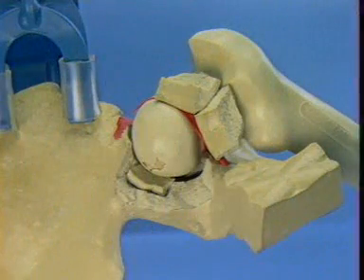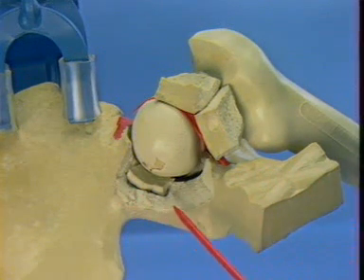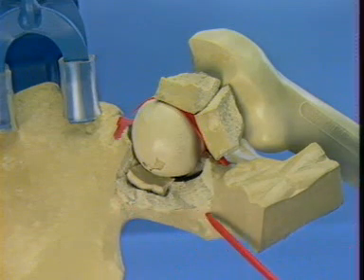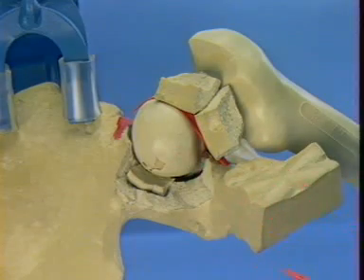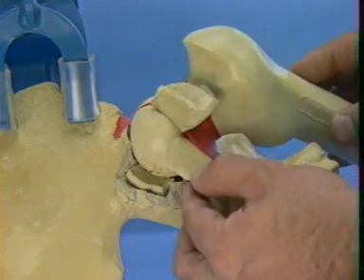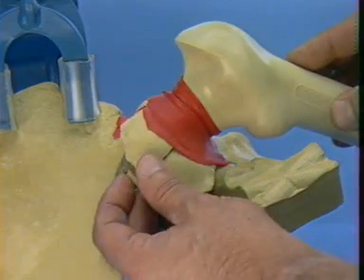The bone is placed in a vise as if the patient were in the lateral position and the surgeon standing behind the patient. After performing a Kocher-Langenbeck approach, the surgeon has a view of the posterior column of the acetabulum and the retroacetabular surface, which is seen to have a defect where the fracture of the posterior wall is. Two fragments of the posterior wall, which include a portion of the retroacetabular surface, are seen attached to the hip capsule.